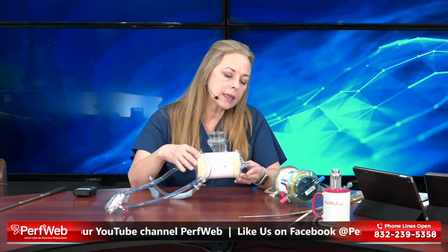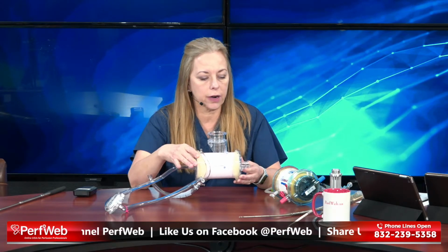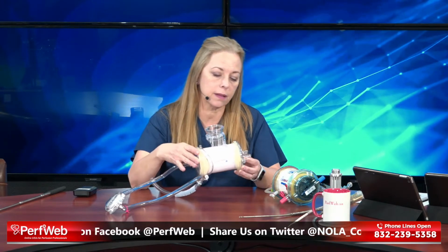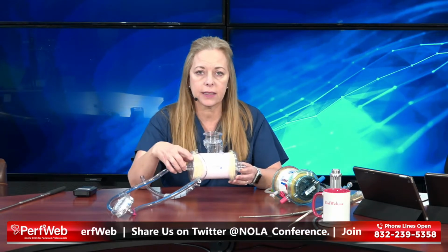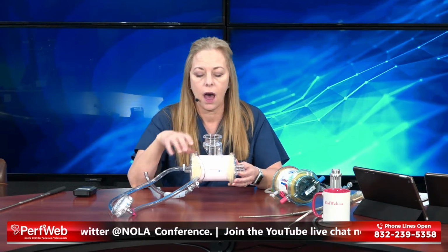And besides the foaming, of course, we're doing oxygenator blood gases in our circuit so that we're able to really keep up with the performance. And this little thing's actually a workhorse. It's a less expensive version of these oxygenators because of the fibers that are inside.